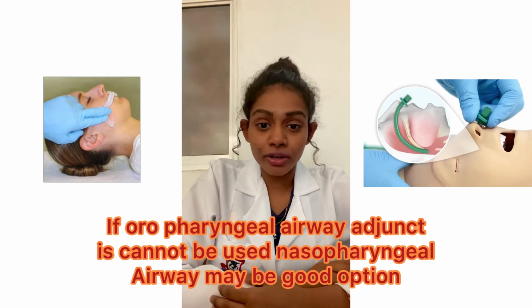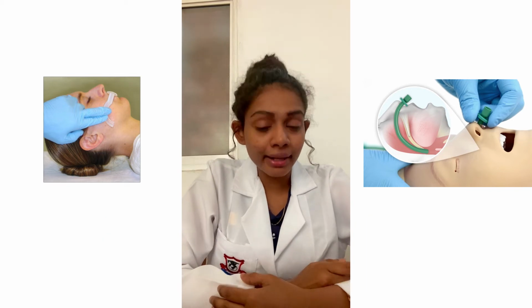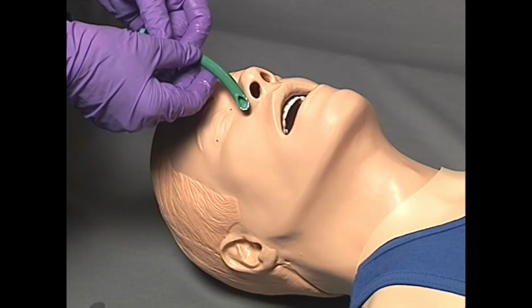For example, in an instance where the patient is unable to use an oropharyngeal airway, the nasopharyngeal airway is recommended. The nasopharyngeal airway is produced in a variety of sizes to accommodate various patients, so it's important to select the correct size of nasal airway.